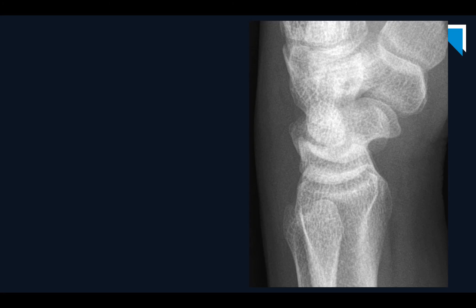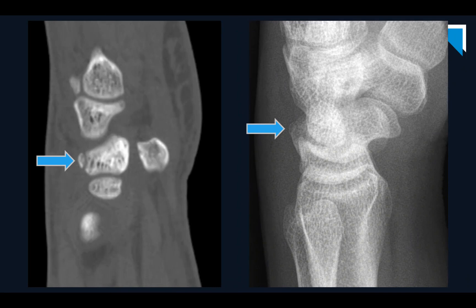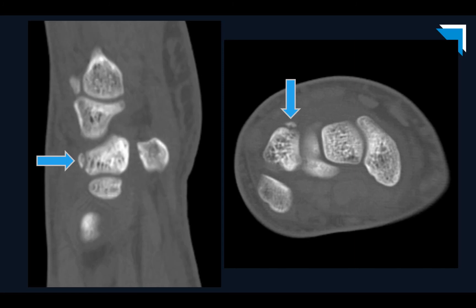We see dorsal soft tissue swelling overlying the carpus. Dr. Shuley saw a very subtle contour abnormality of the triquetrum and prospectively called an acute triquetral avulsion fracture. The patient went on to get a CT, and sure enough, it looks exactly like the x-ray — there's an acute triquetral avulsion fracture with a tiny little fragment. Here is the axial view showing the same thing. Really nice call off that x-ray.